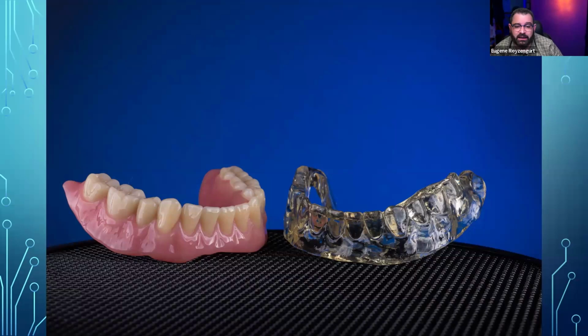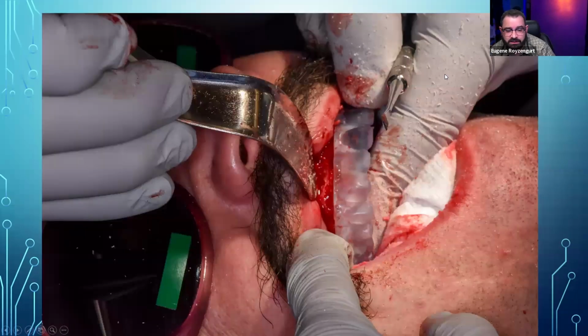But nowadays, what I basically do is I do these printed. And with printed, you can see I got a line here to where I need the bone reduction to be done. Let's say, for example, this particular case, we did locators. So from the incisal edge to the bone reduction, you need 12 millimeters. If you're doing an acrylic hybrid, wraparound, you need at least 15, 16 millimeters. So this line will show you where you need to cut things and get things done.